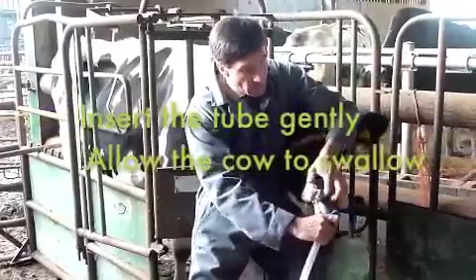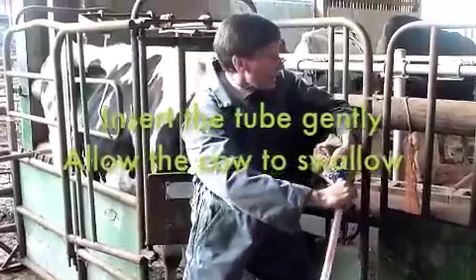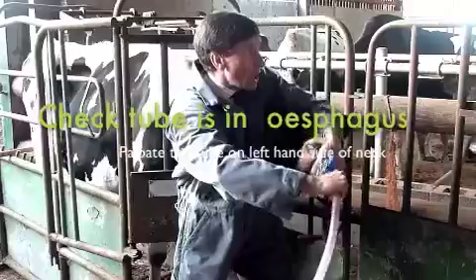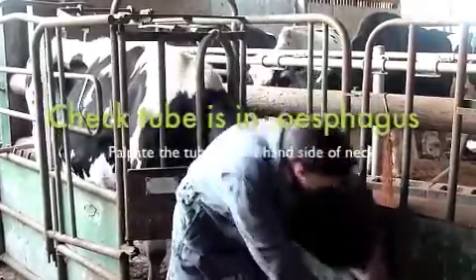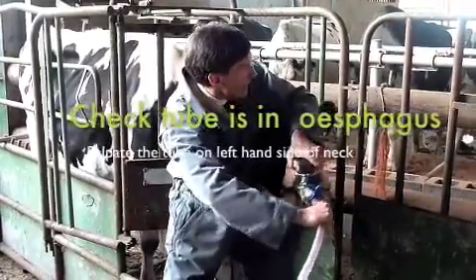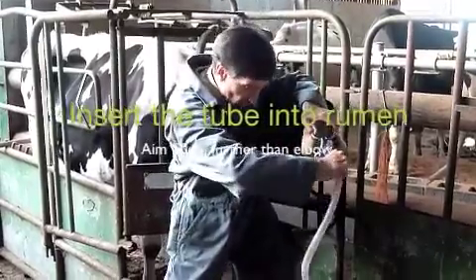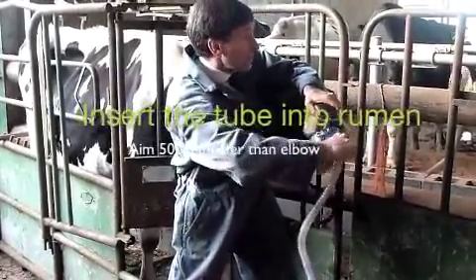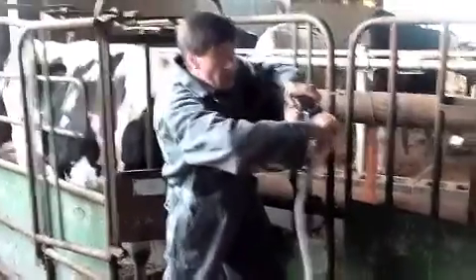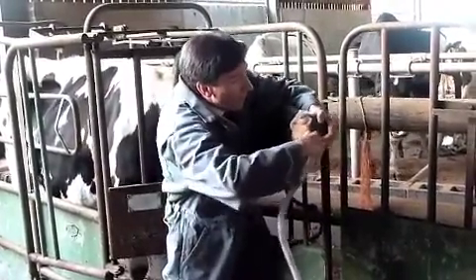Next thing to do is to run the hose in through the gag — just do a gentle bit because that'll encourage her to swallow. On the left-hand side you should see it go down the jugular groove just above the windpipe; you should see it passing down there. You want to go so that it's at a point more or less midway between her elbow and her side. Don't pass it down too far because if you do you tend to get some reflux of rumen contents.